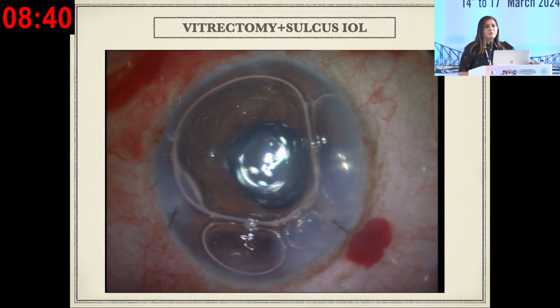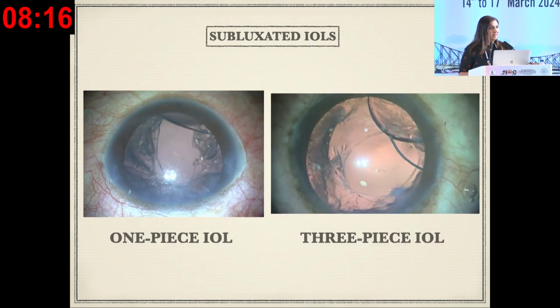See, the basic rule is, when you are winding up your case and you are still not happy with it, and you still feel that this is not my 100%, I know this is not good, that means it is not good. It's not going to be good the next day. It's not going to happen that, okay, let me see what happens tomorrow. No, nothing will happen. It will deteriorate. If you are happy settling up your case on the table, then probably yes, you have good chances.